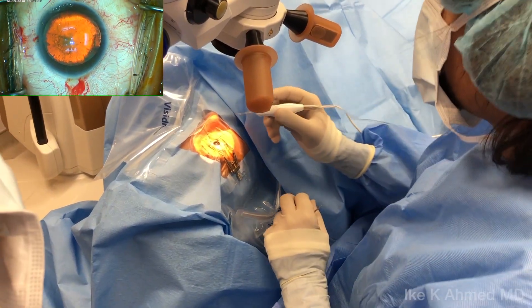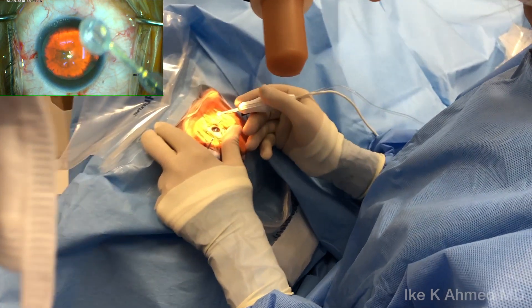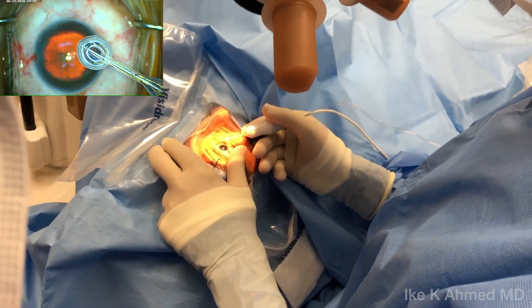This is the Zepto Precision Pulse Capsulotomy disposable handpiece. We're examining the top and bottom, ensuring we have proper configuration of the elements.